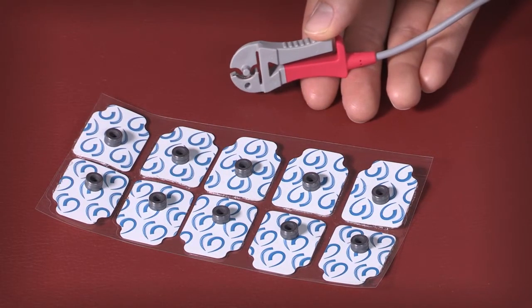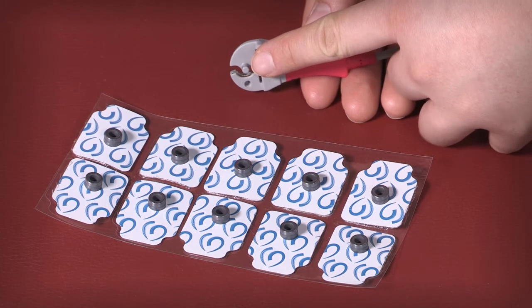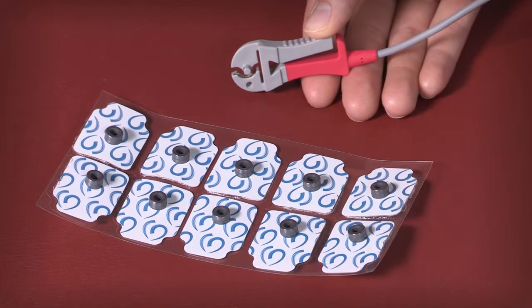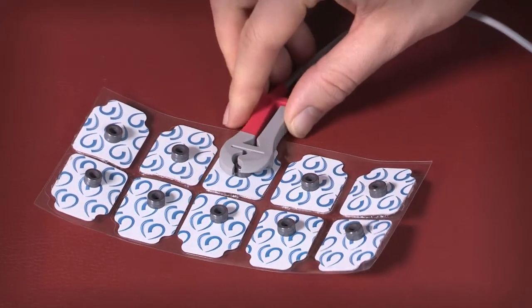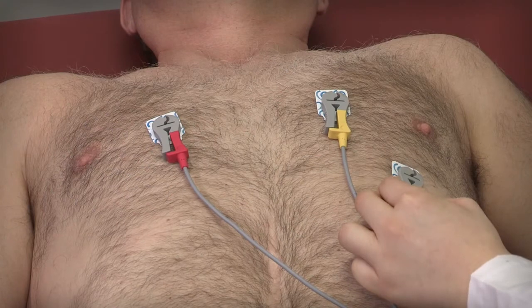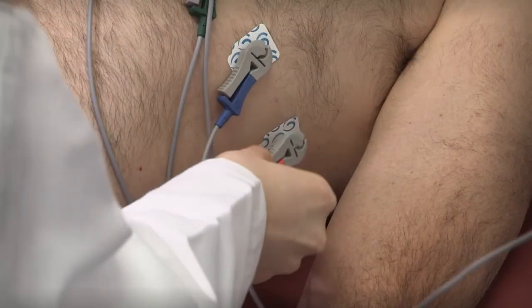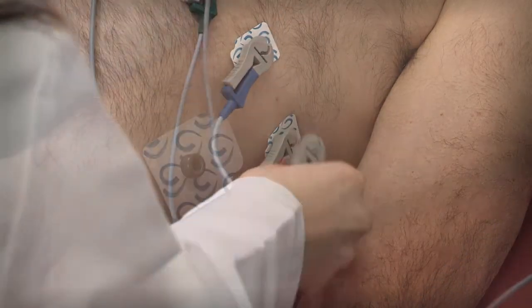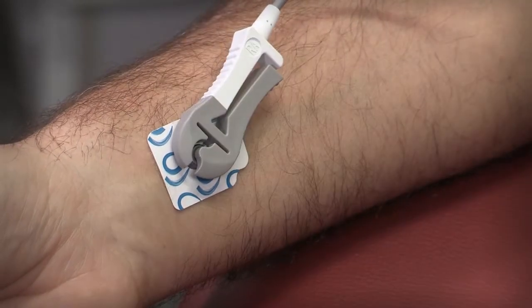Connect the MyoVista patient cable. The center post on the cable grabber lines up with the hollow center post on the electrode. Squeeze the grabber of the cable and insert the post into the hollow center post on the electrode. Repeat this process for all precordial and limb leads. Make sure you have connected the proper leads to the appropriate electrodes per standard placement protocols. The cables are labeled for easy reference.